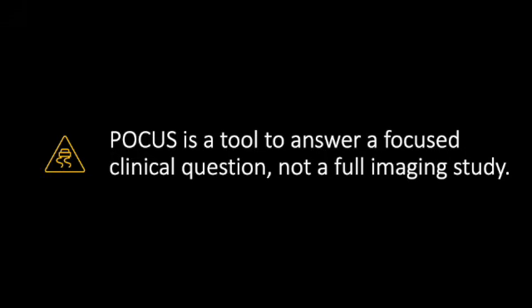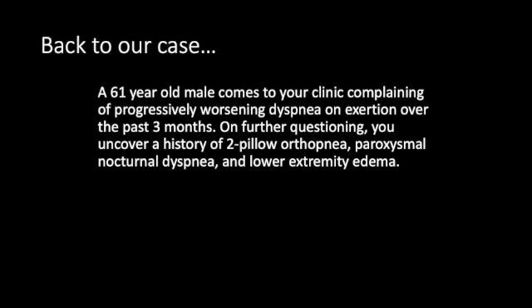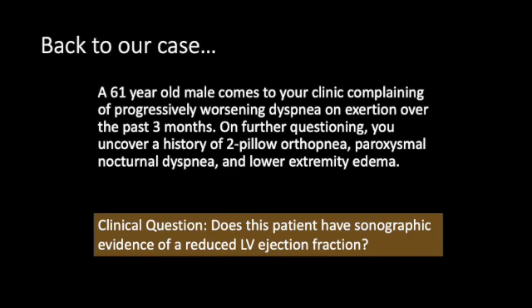I know you've seen this slide before. So if we go back to our case, what might be the clinical question for this patient? Well, a broad question would be, is heart failure the reason that this patient seems to be volume overloaded on exam? And then if we wanted to refine that, we could ask, does this patient have sonographic evidence of a reduced left ventricular ejection fraction? And this is a question that's well suited to answering using point-of-care ultrasound.